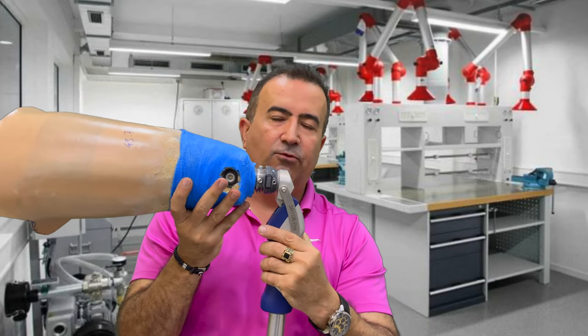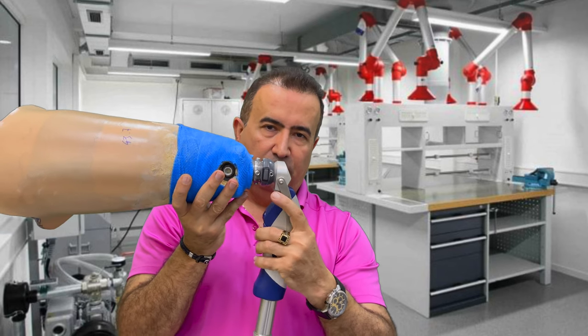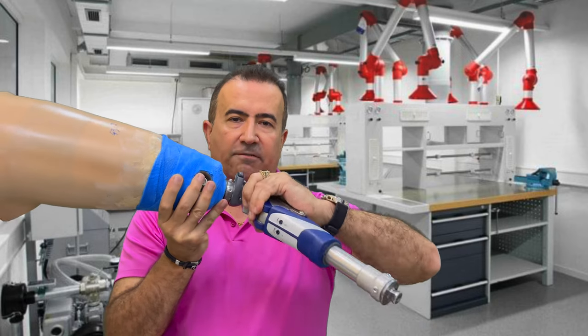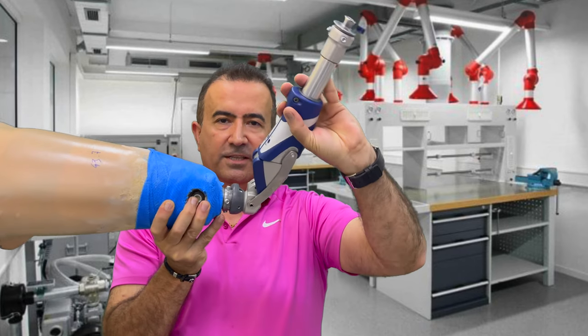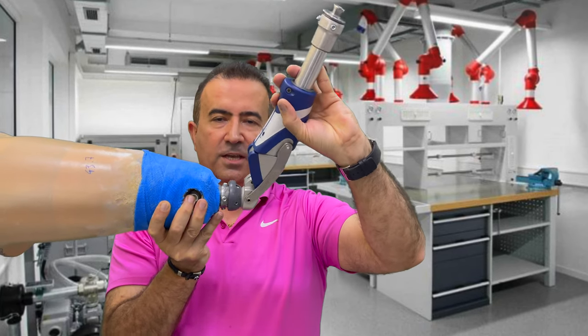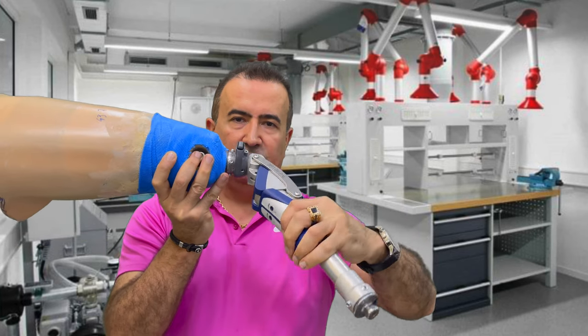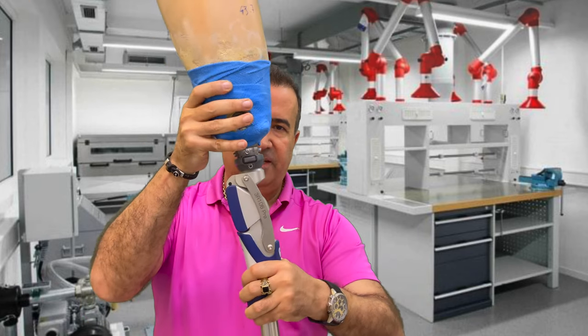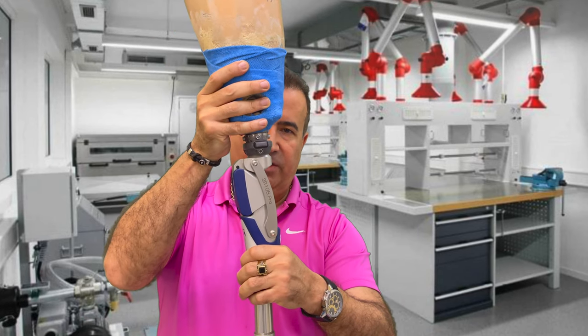When the knee is in fully flexed position, you can just press it here and without any problem, you can bend the knee in any direction you want. After you are finished, just turn it back and it will be locked automatically. And this is safe and locked, you can walk again with that.